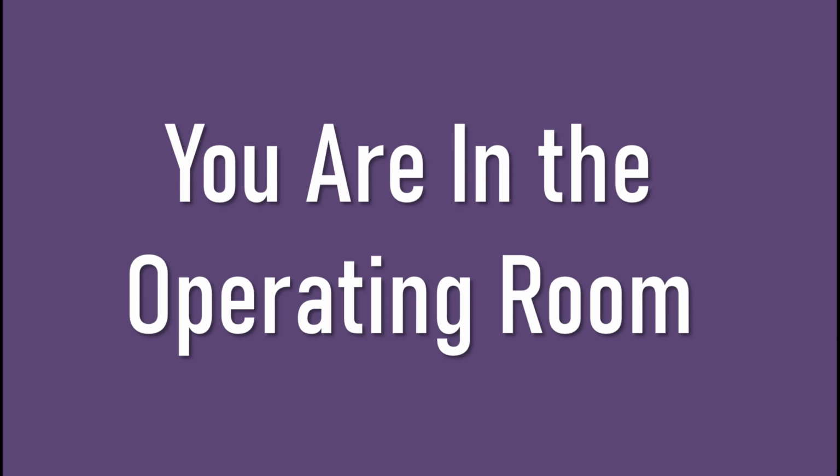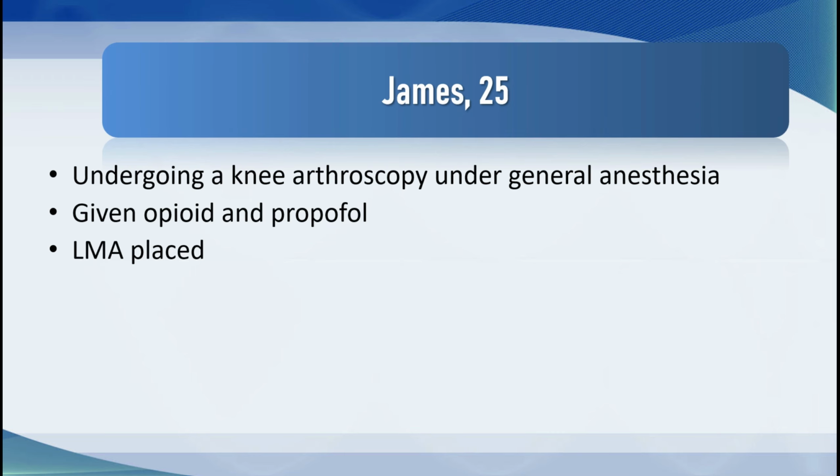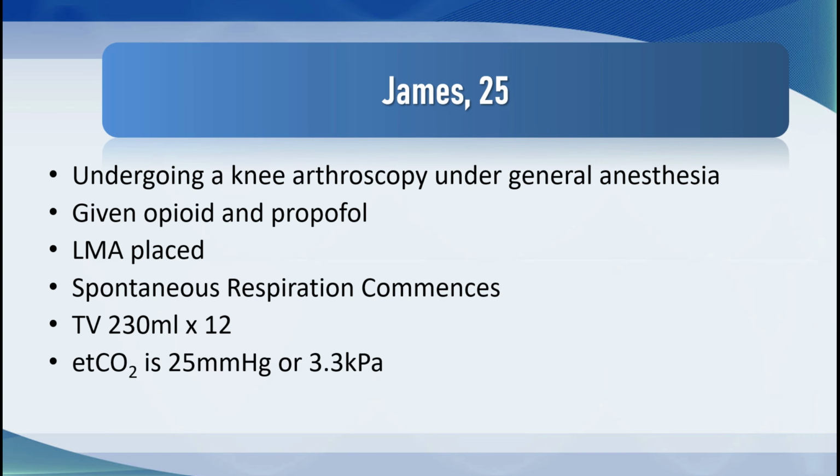Now let's move on to low end tidal CO2. You're in the operating room looking after James, who was undergoing knee arthroscopy under general anesthesia. He's given an opioid and propofol, an LMA is placed, and he is put on volatile anesthetic agents, and he starts to breathe spontaneously. His tidal volume is 230 mils 12 times per minute, and his end tidal CO2 is 25 millimeters of mercury, or 3.3 kilopascals.